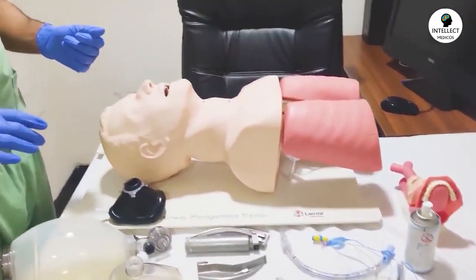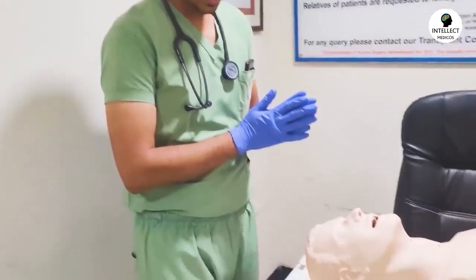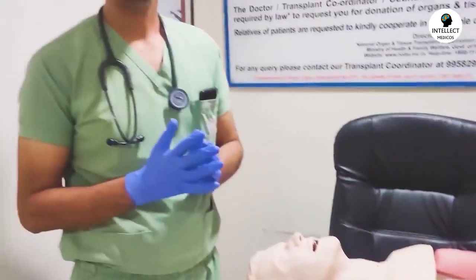Coming on to the procedure, how to perform it. First of all, you need to take all the universal precautions. That means you need to wear gloves and a mask. Now we are working in this COVID era, so we need to wear a mask. That is mandatory before performing any kind of procedure, before intubating or even bag and masking, you need to have your mask, right?